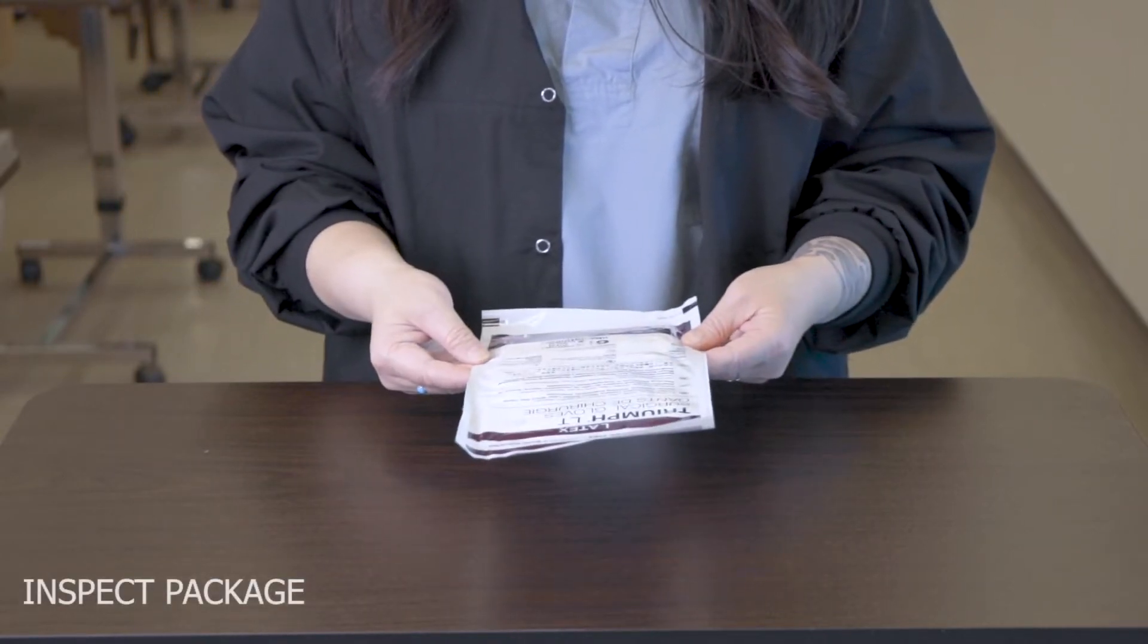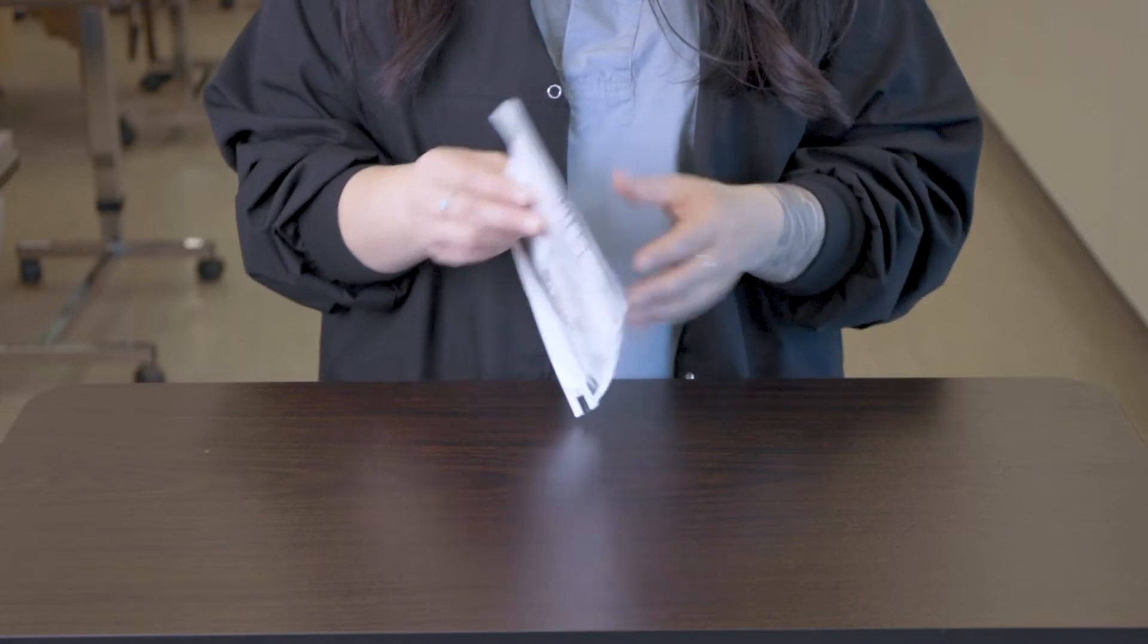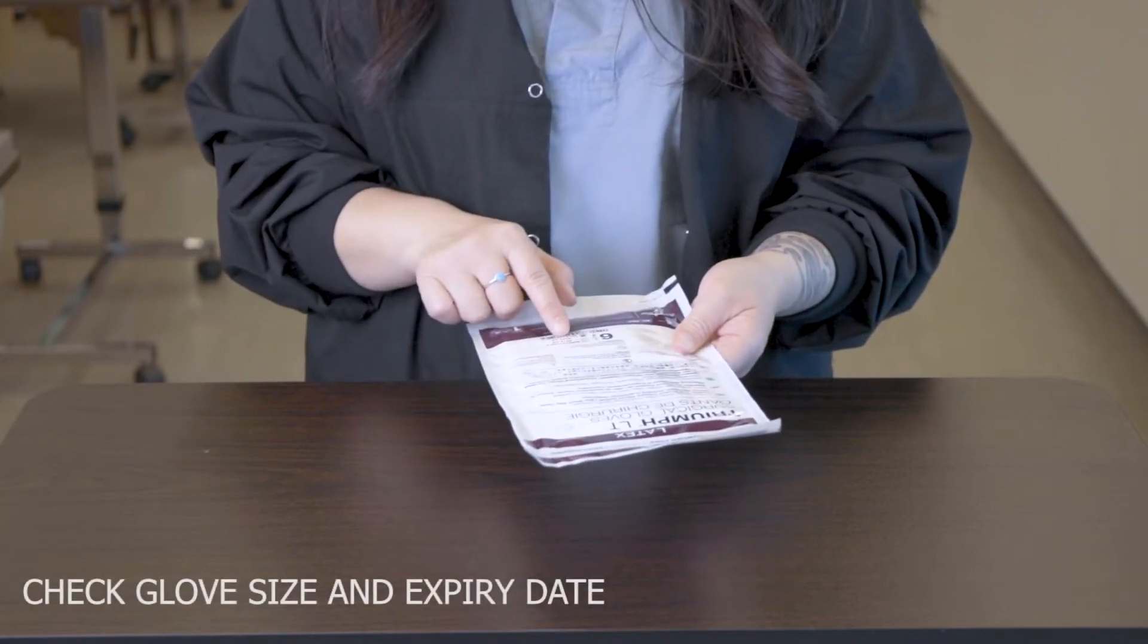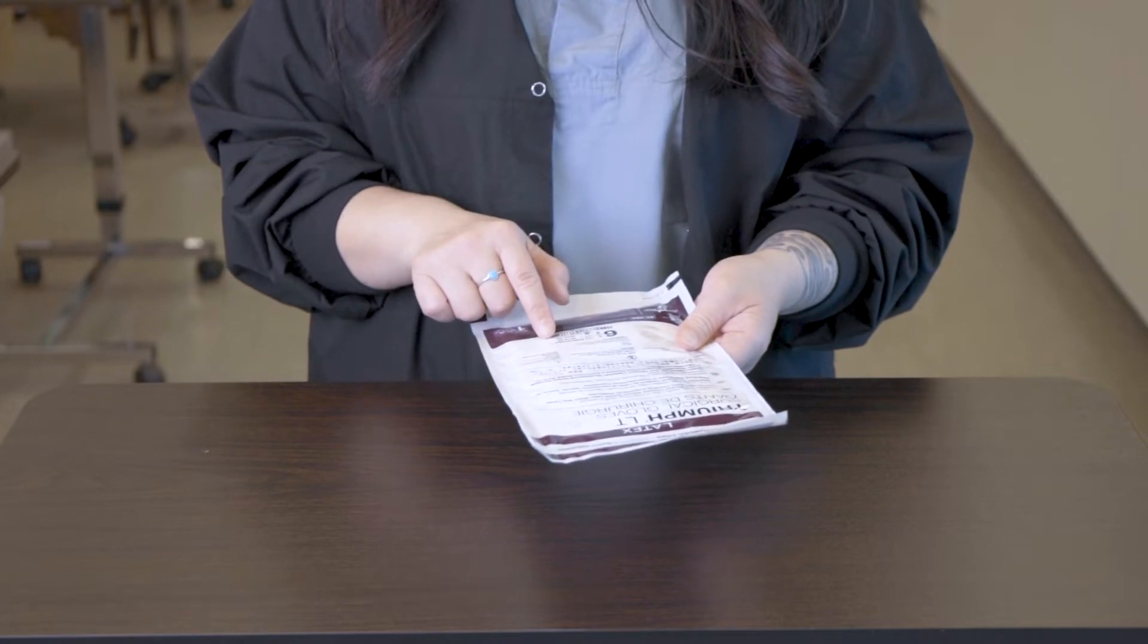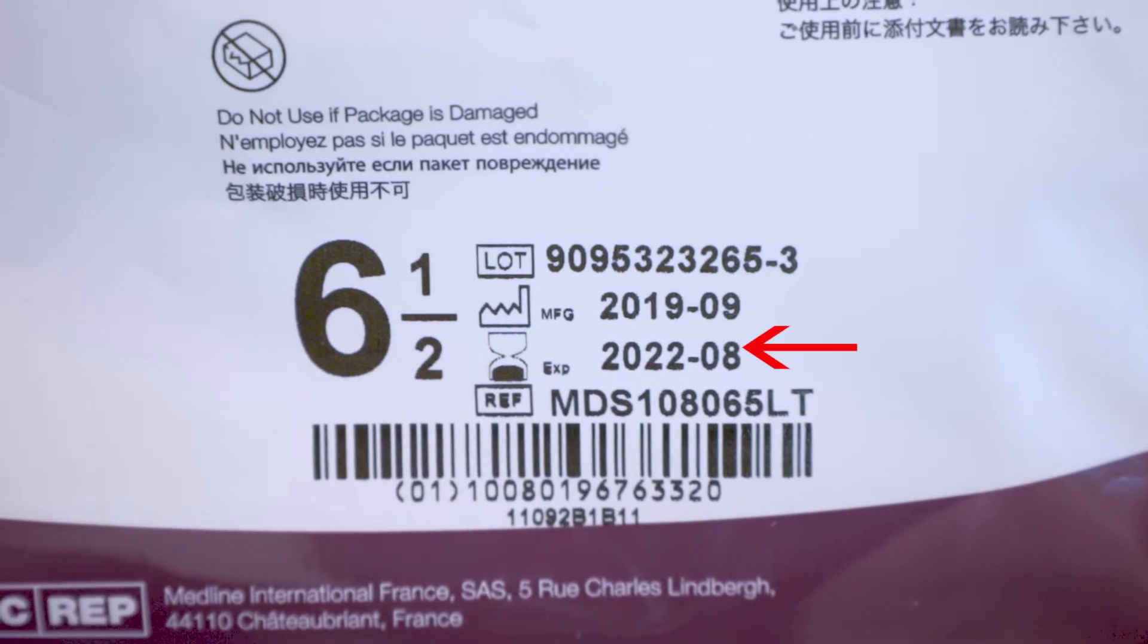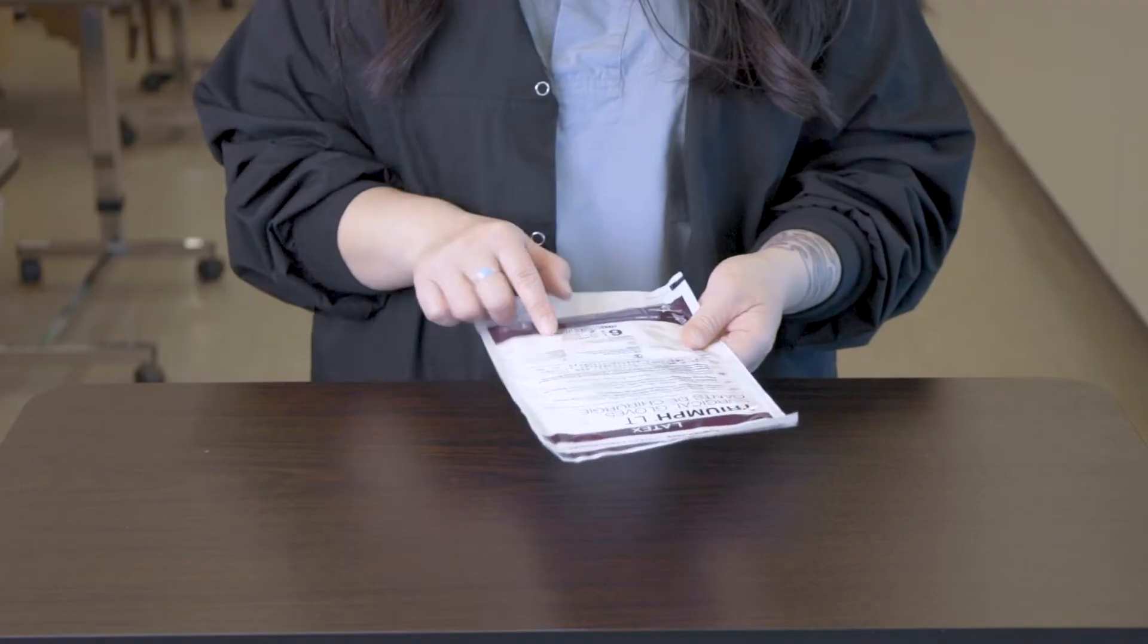Then I'm inspecting the package to ensure that it is intact, and I also want to check the glove size and the expire date. Here I'm using a size 6.5, which is in between a small and a medium, and here we can also see that the expire date is 2022 of August.